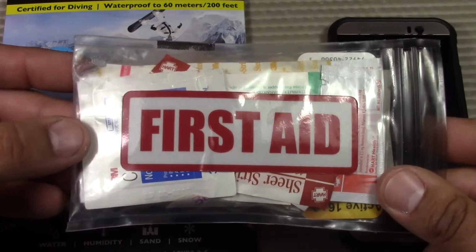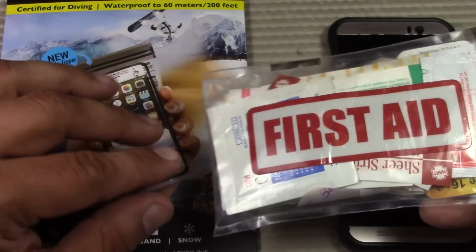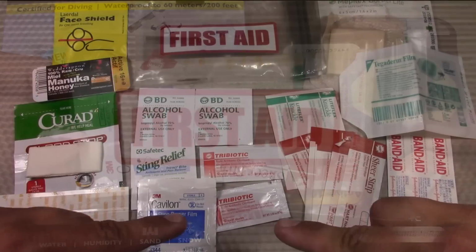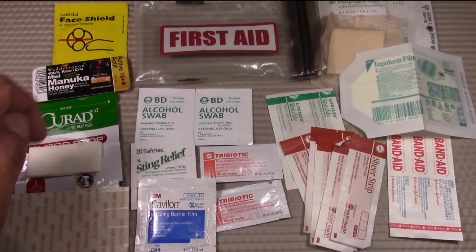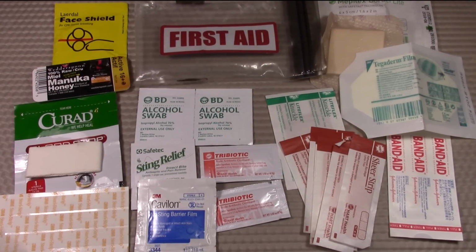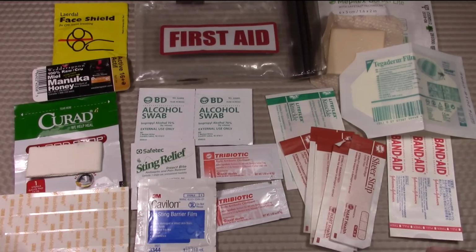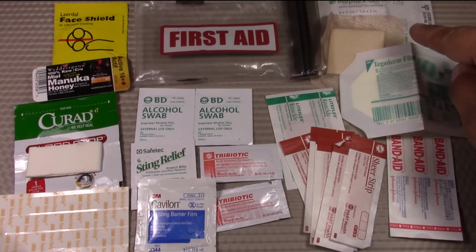So I'm just going to take all the items out of this first aid kit, and we'll talk about all of them in detail, and then we'll start constructing some new ones. Here are all the items that were stored in that small Mini Medi kit. So as you can see, it's kind of a boo-boo kit. We have small band-aids, triple antibiotic ointment, alcohol swabs, but we also have some of the modern wound dressings, which we've talked about in other videos.